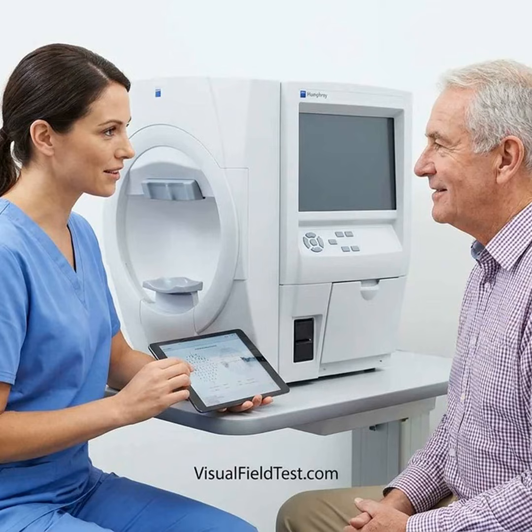Because the test depends on attention, understanding, fixation, and timely responses, patient education can directly affect the quality of the result. Anxiety, fatigue, unfamiliarity, incorrect responses, and difficulty maintaining fixation may lead to unreliable findings or unnecessary repeat testing. In a prospective study, higher pretest anxiety was associated with greater visual field unreliability, while patients who had completed more than 10 previous tests reported substantially less anxiety.